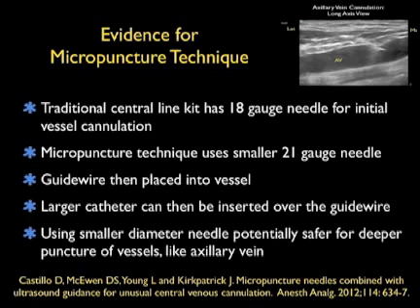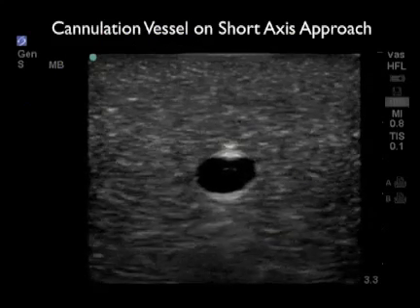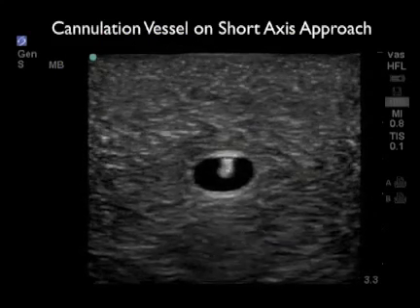One can then use this smaller 21 gauge needle to cannulate the vessel and place a guide wire into the vessel. A larger catheter can then be inserted over the guide wire into the vessel. Using these smaller diameter needles is potentially safer for deeper puncture of vessels like the axillary vein to avoid potential complications. In this video clip, we'll watch cannulation of a vessel using the short axis approach.